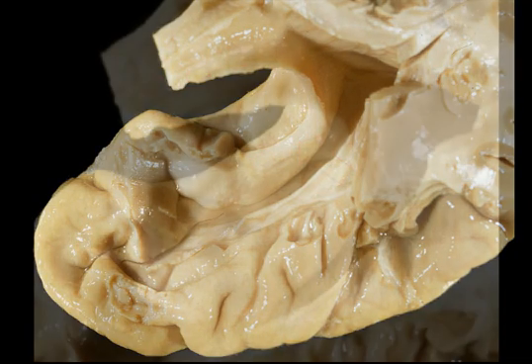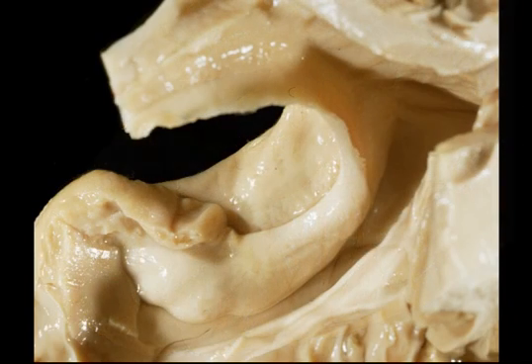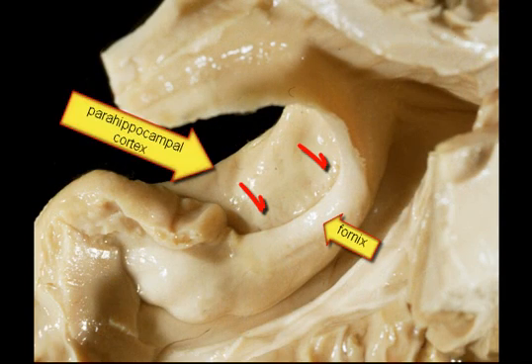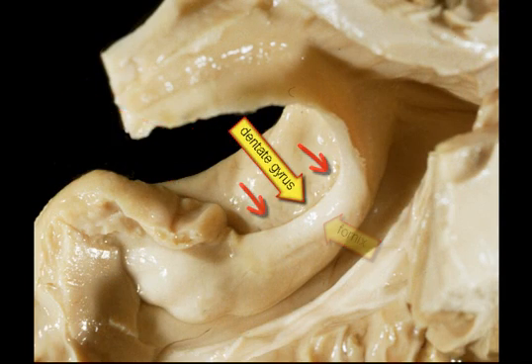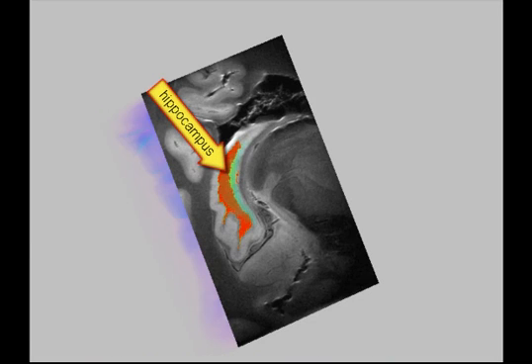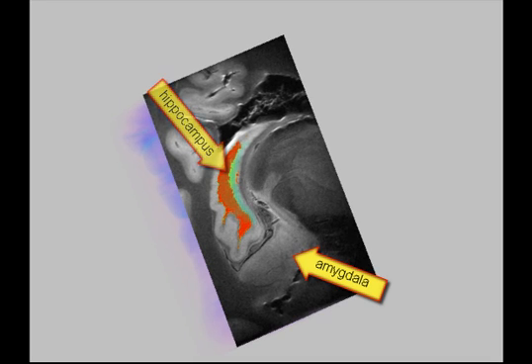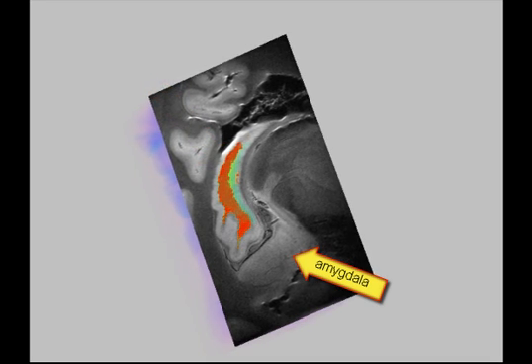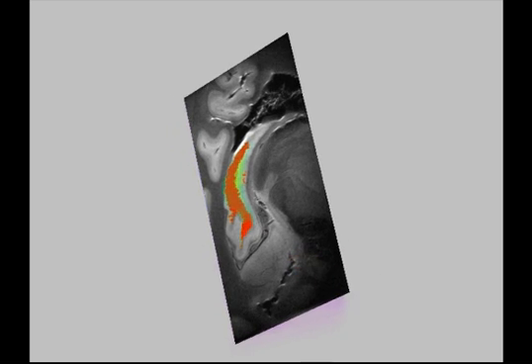In between the parahippocampal cortex and the fornix lies the dentate gyrus. We downloaded a 9 tesla MRI of a human hippocampus, taken post-mortem and downloaded from the website of Penn State University, and rendered here in VP Microlab.